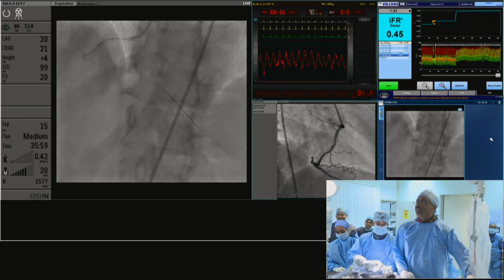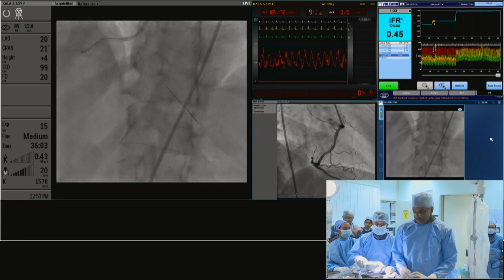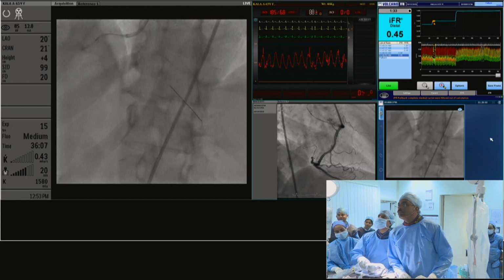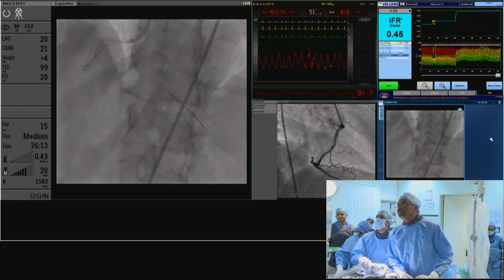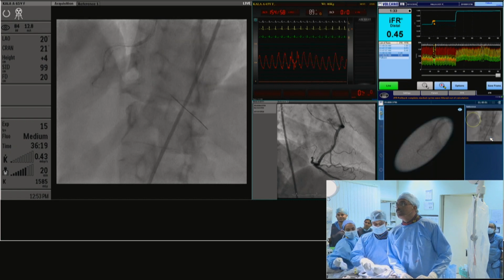In a calcified lesion, which is distal, the biggest problem we face is the proximal part of that artery, which challenges us in getting the devices to that target. And inadvertently, we end up damaging it, touching it, or engaging those not so significant plaques. So how do you use IFR in tandem calcified lesions of this sort?